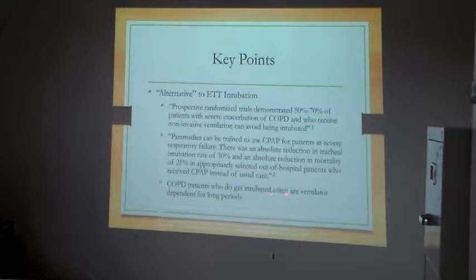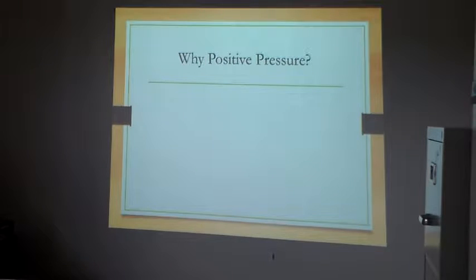And patients who don't get intubated, often, patients that do get intubated, are on the ventilator for a long time. You don't go on the ventilator for a day and come off. That's not a thing, especially if you're a COPD patient. Once you go on, typically you're on 5 to 7 days. It takes a while to wean you off. Okay? So, what does that mean for us? Positive pressure redistributes lung fields. So, we use this in conjunction with a couple other things to open up those lung fields, open up those blood vessels, push that fluid out.